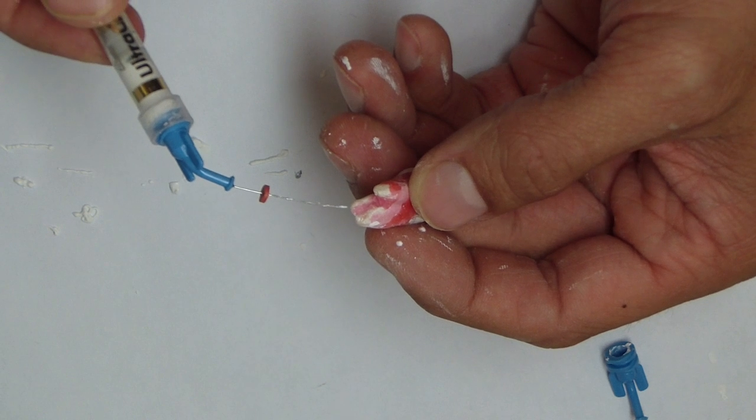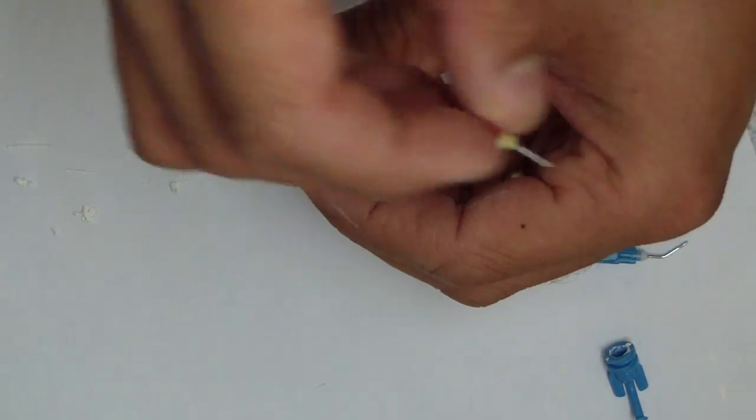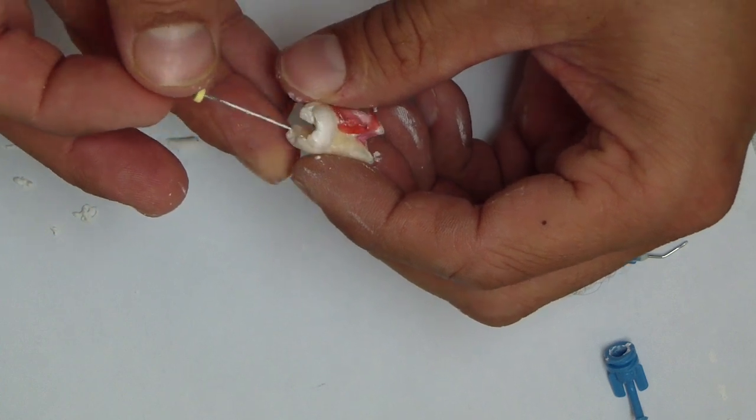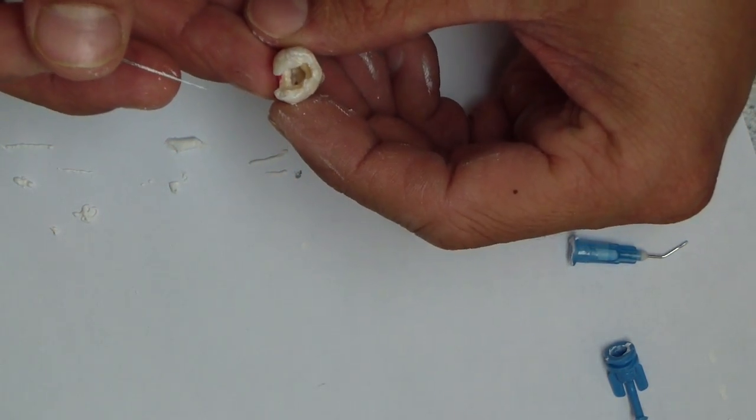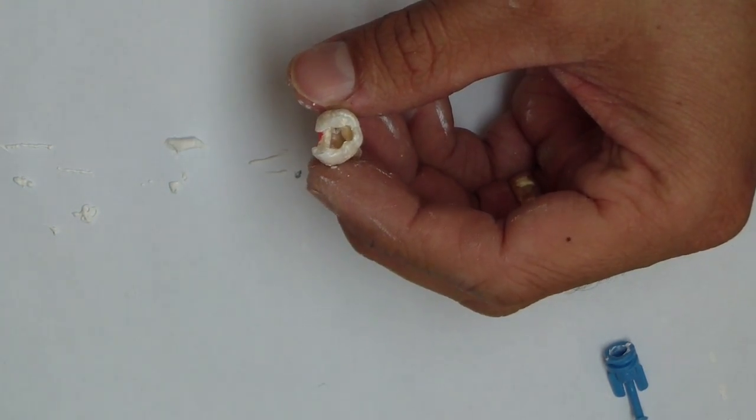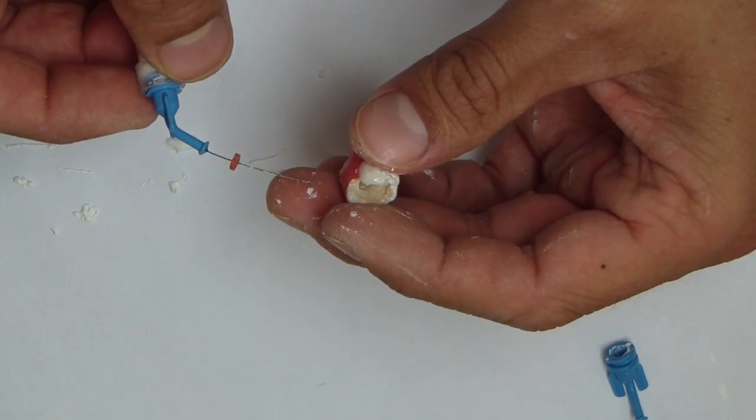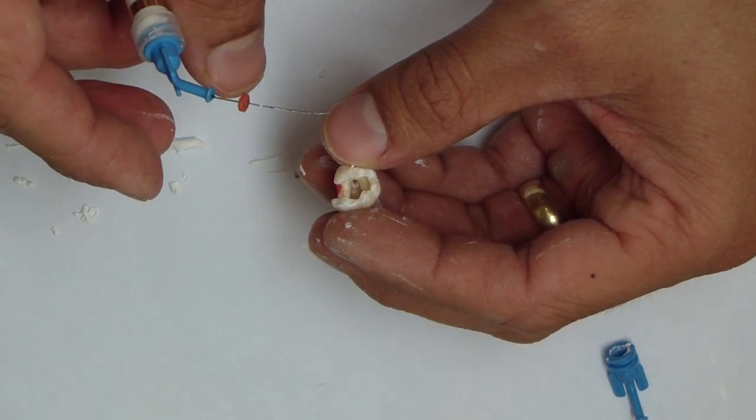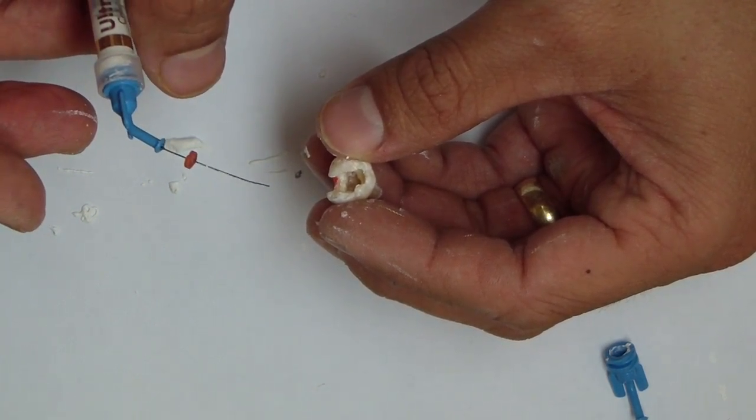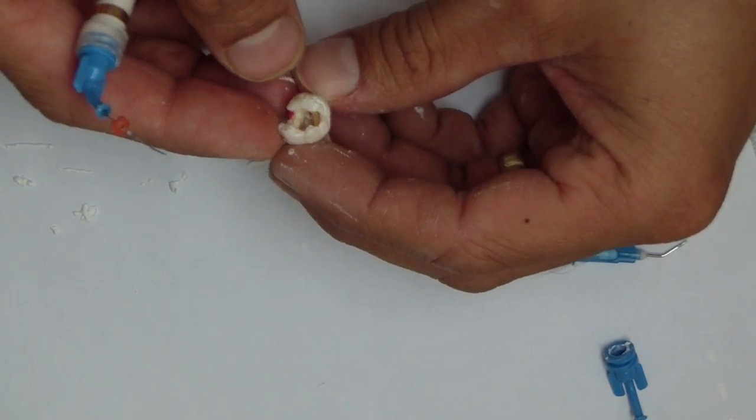I've tried not to extrude any of the apex. You could take a file and run it down there, I suppose, but you've filled it to the point where—yeah, don't do that, because that will pull it out. I haven't done that for years. Once it's in there, just leave it. The whole intent is to ensure you have a nice dense fill of calcium hydroxide contacting all the walls, to eliminate as many micro-organisms as possible. I hope that helps—some food for thought in placement of calcium hydroxide. Cheers.